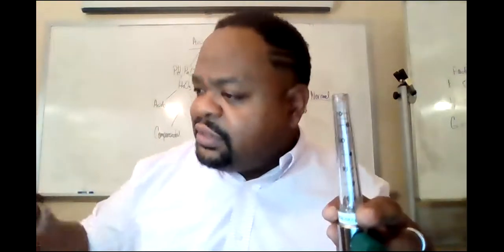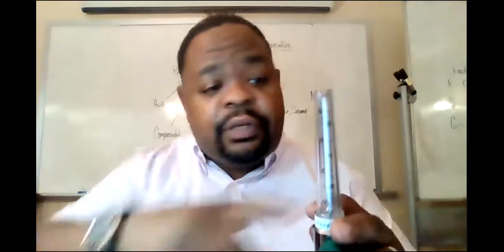Right? So you always check your patient from the patient back to the modality to see if there's a kink, a leak, a break, anything, right? You say, well, damn, he's turning blue. Let me look. It's in his nose. Let me follow the line. Ooh, it's cut or it's kinked. Let me undo that. That's how you have to assess in an emergency situation, okay? So an uncompensated Thorpe tube would not be accurate in the presence of back pressure. It's going to keep on reading what you thought he was getting. If it's compensated, it will be accurate and it'll start dropping if there's a back pressure or kink involved, okay?